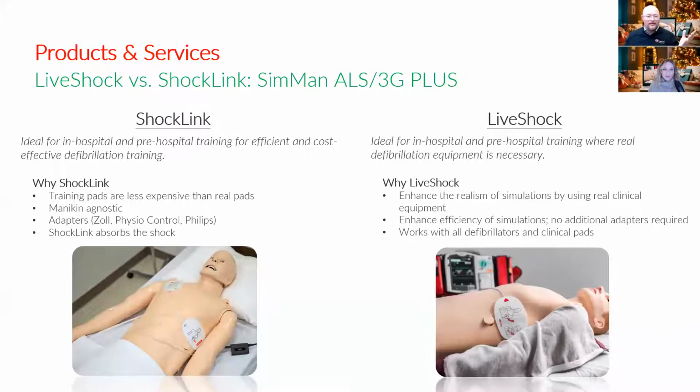So ShockLink versus LiveShock. This is a big question, the two different things. If you're ever wondering which version you should go with, here are some great points. ShockLink is ideal for in-hospital and pre-hospital training. Some things that would really send you in the ShockLink direction: some of the training pads are less expensive than the real ones. It's also mannequin agnostic, which means you can use ShockLink on a different vendor's product, on our products, on a pumpkin, a Christmas tree, or a drawing of a person on a table. ShockLink can be used anywhere.